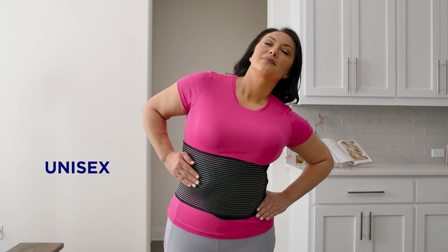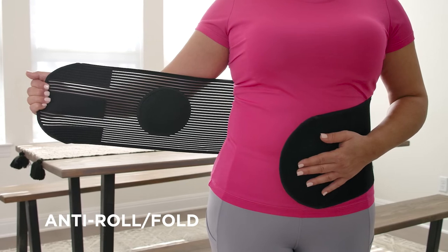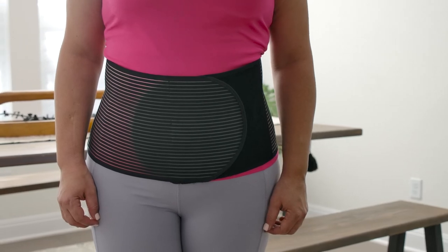Our unisex hernia belt is also hand washable and latex free. The belt has an anti-roll and anti-fold design that secures onto your body with velcro closure. Speed up your recovery with the Armstrong America Hernia Belt with Pressure Pad.